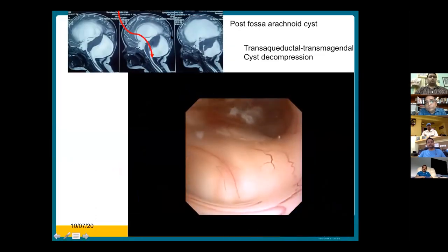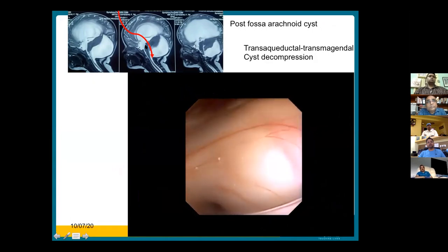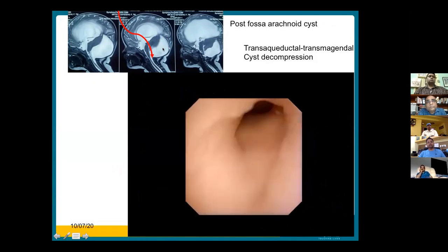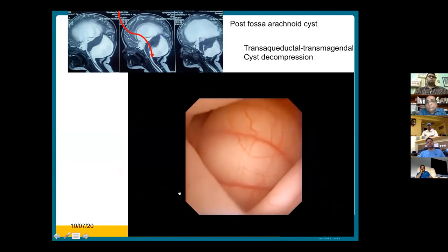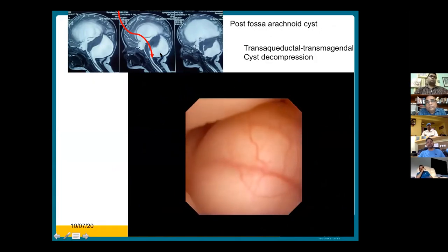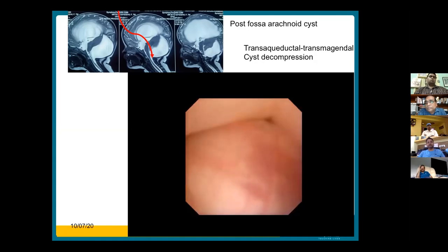So the next thing we did was we went beyond a cyst which is bulging into the fourth ventricle. What about a large subset of cases where there's a large retrocerebellar cyst? You can do a straight away shunt or do a marsupialization, but my personal experience with this was not good, because we had numerous instances of pseudomeningocele and CSF leak and all shunt related complications because the shunt is placed acutely in the neck when you put a shunt.